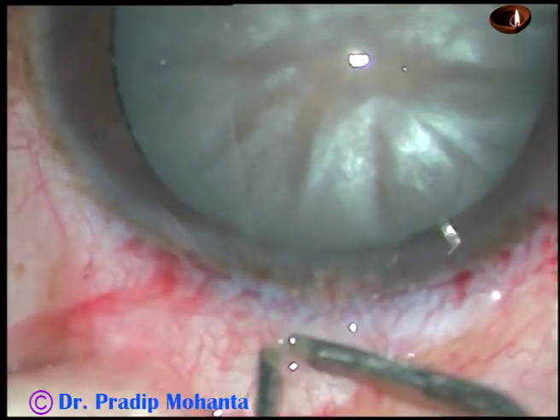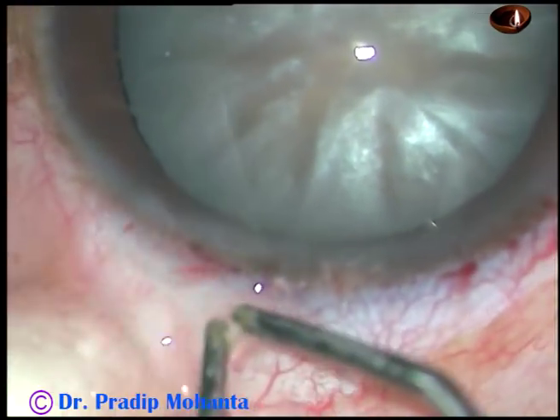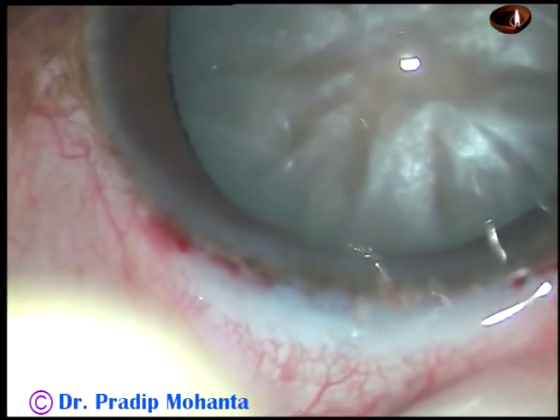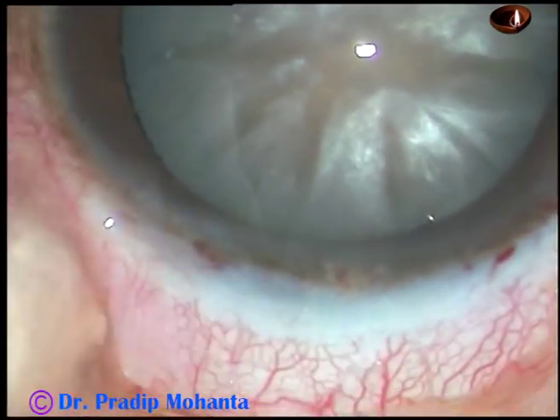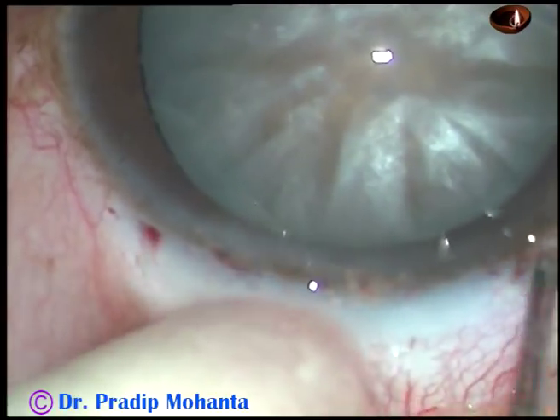Wet field cautery is done just 1 mm behind the limbus. A lot of blood vessels are not destroyed. This is enough.